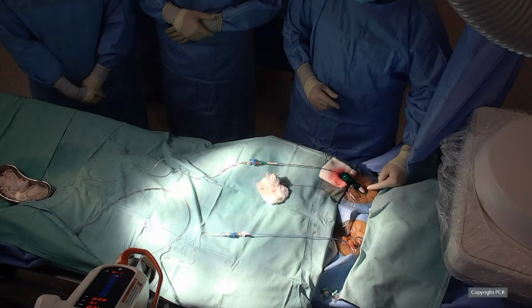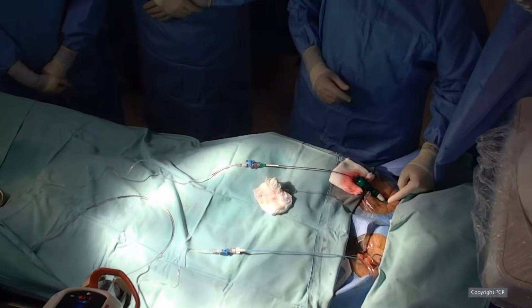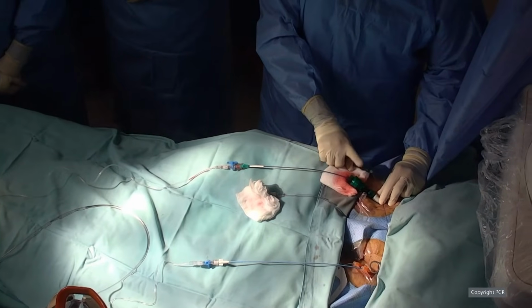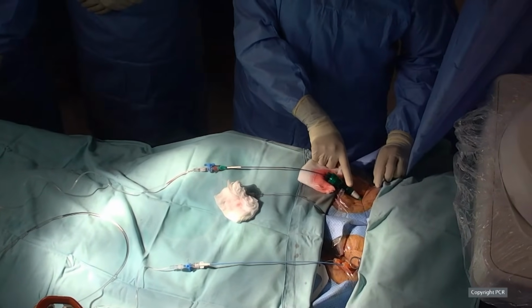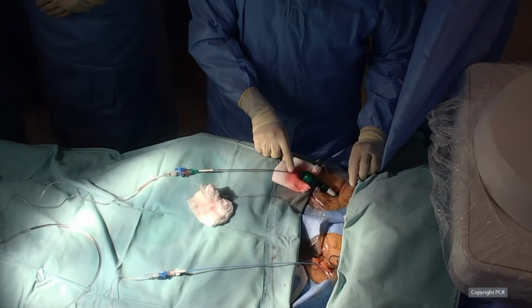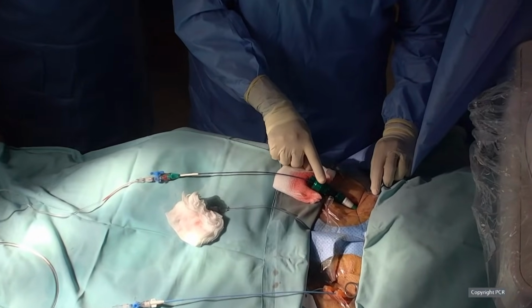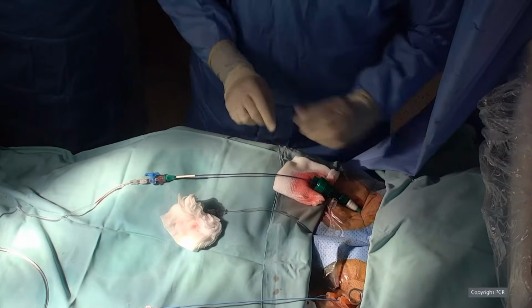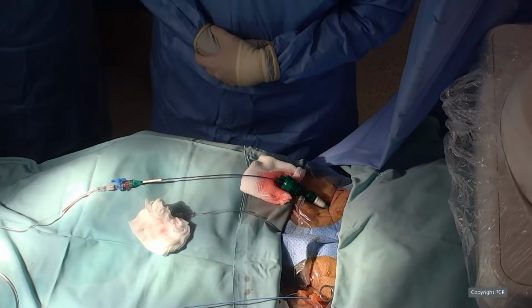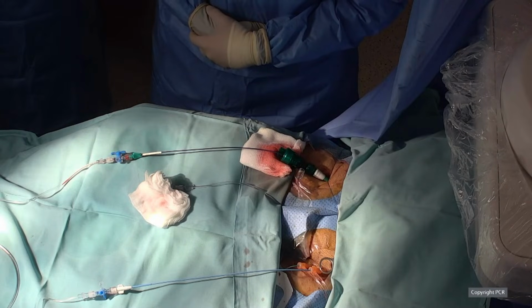After that, a 9 French sheath was placed in, and over an Amplatz extra stiff wire, we've advanced the 14 French Python sheath. This was done after pre-dilating the tract, the common femoral and iliac arteries with a 14 French dilator. After placing the sheath in, the sheath itself was dilated again with an 18 French dilator to ensure that we'll have a seamless delivery of the valve to the aorta and the annulus.